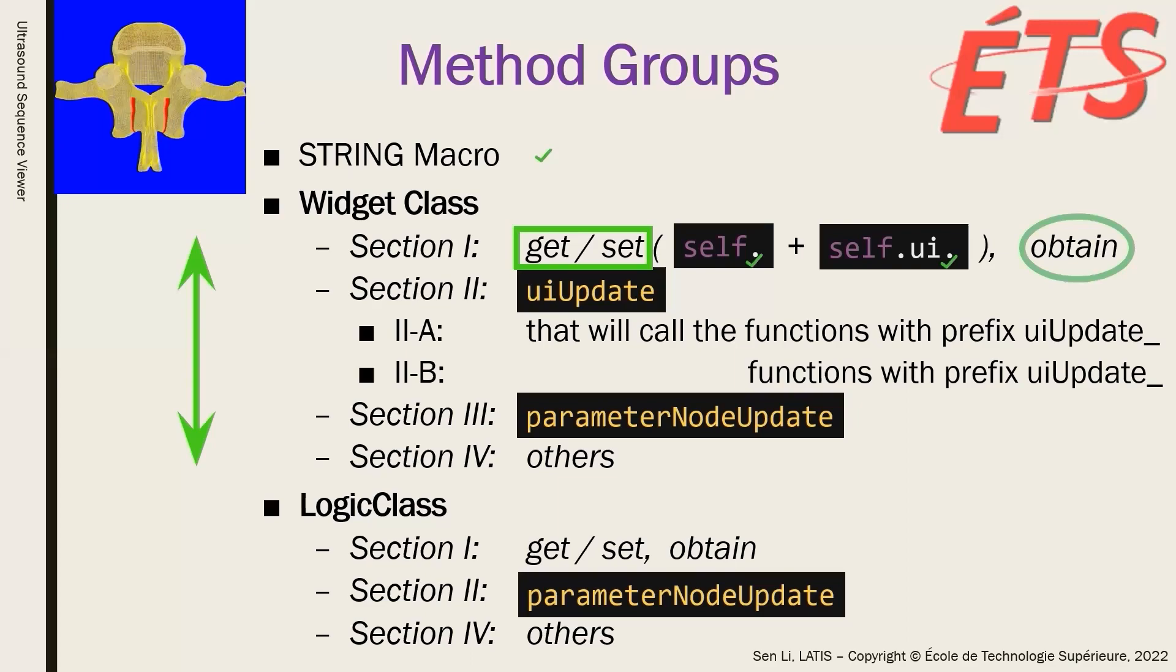Section 2 contains the update of user interface-related functions, which include group capital alpha and group capital beta, as we introduced in the third rule to make the module robust.